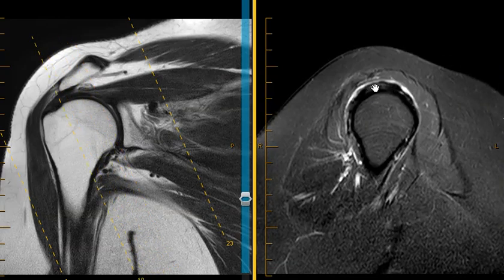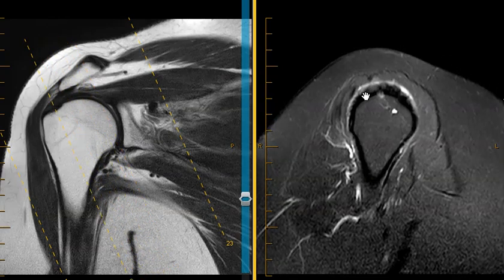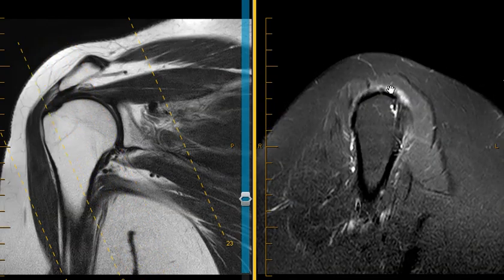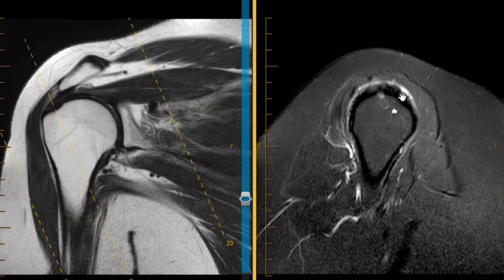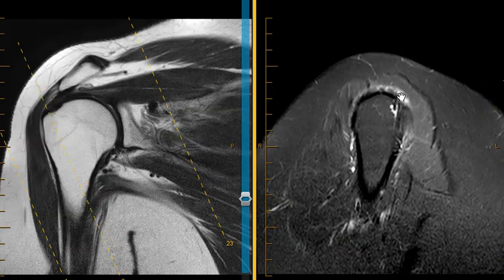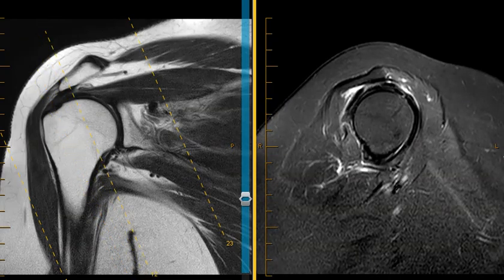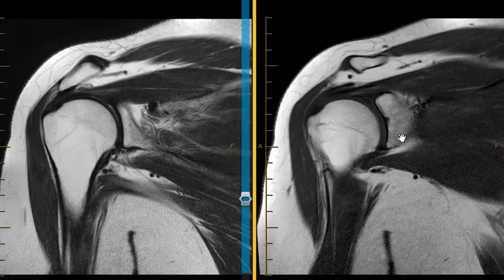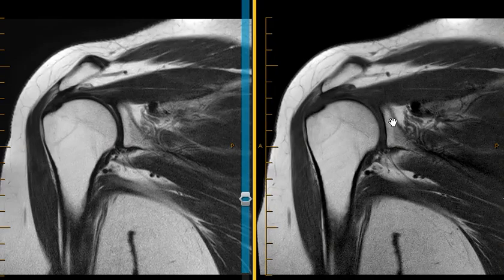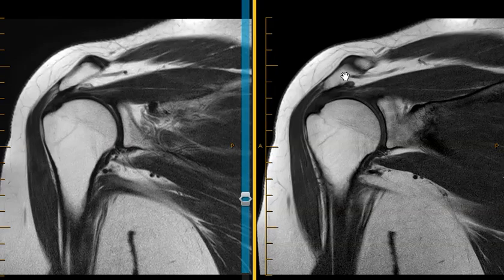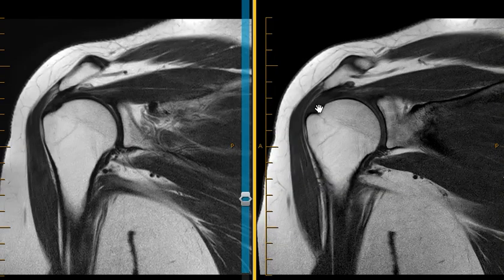The rotator cuff is not jet black, it's gray — so they have tendinopathy of the rotator cuff. This is a really common, classic case of abnormal configuration of the acromion with rotator cuff tendinopathy and acute bursitis.